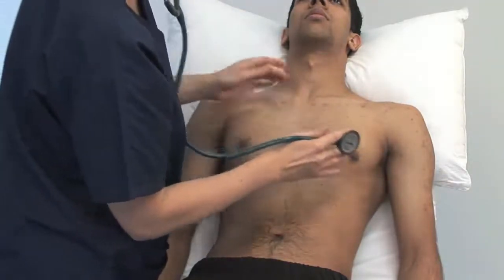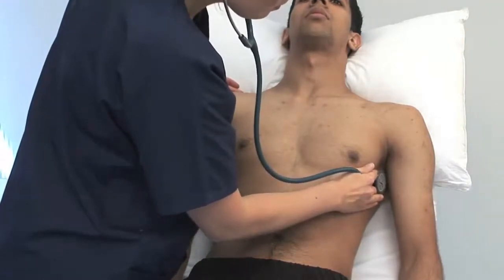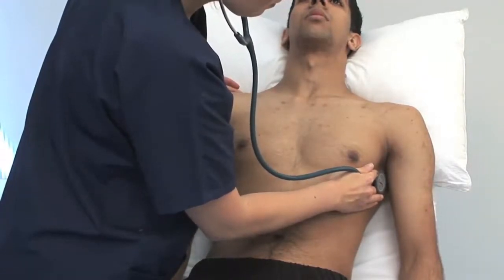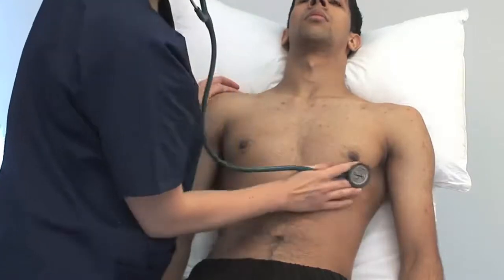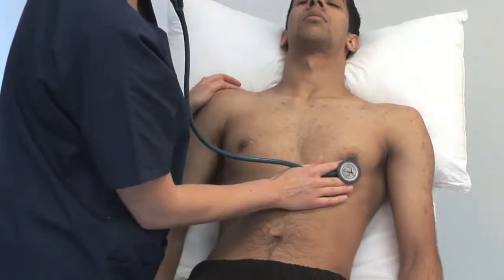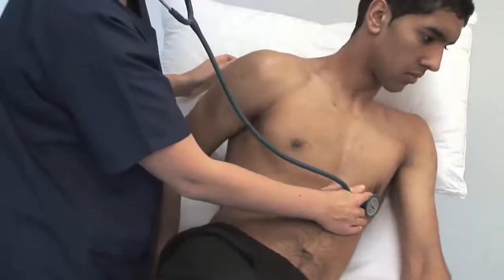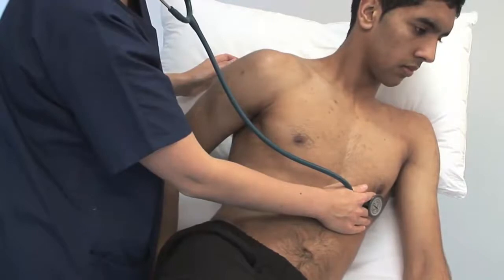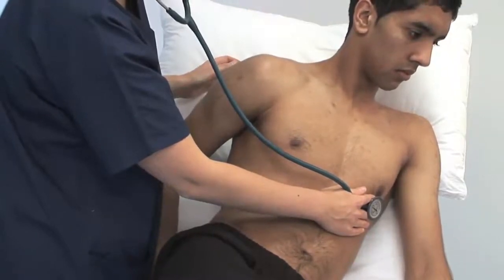Next, listen specifically for mitral stenosis with the bell at the apex. Please could you roll onto your left hand side. This is accentuated in the left lateral position. It's a mid-diastolic rumbling sound which may follow an opening snap.